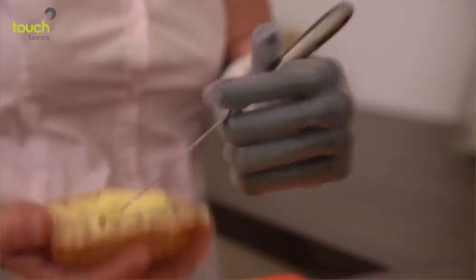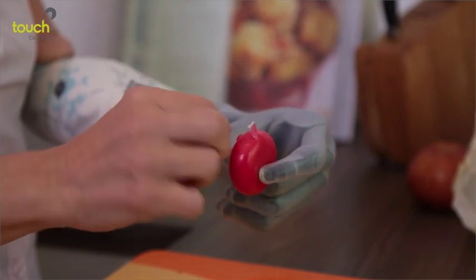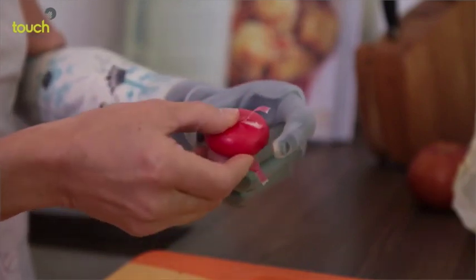And another thing you'll notice in these videos too, she's always using the prosthesis as the helper hand, right? She's using her sound hand to do most of the dexterity.